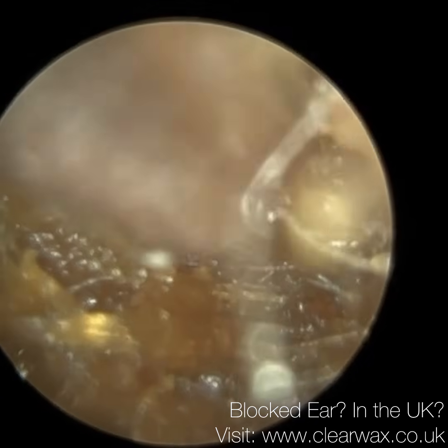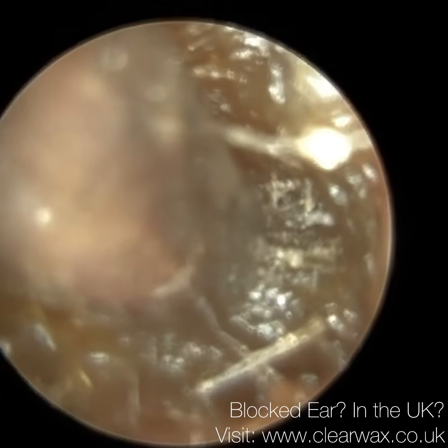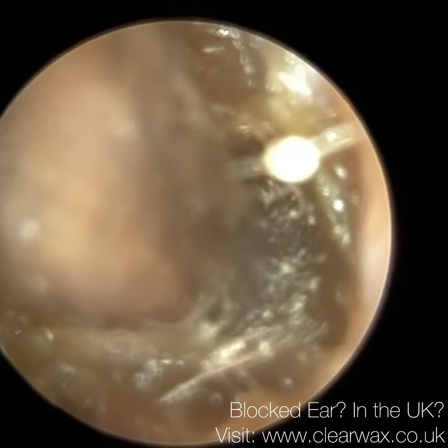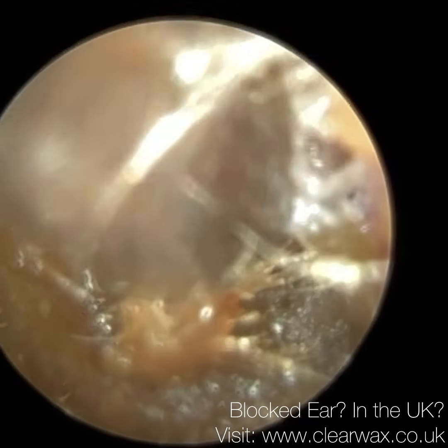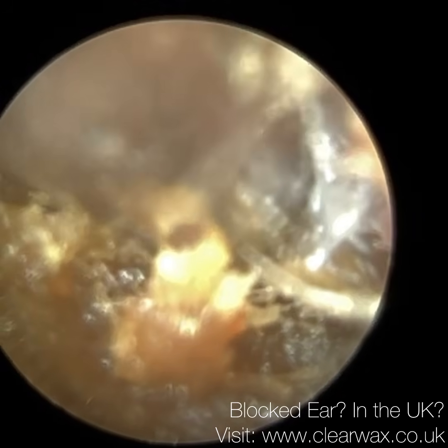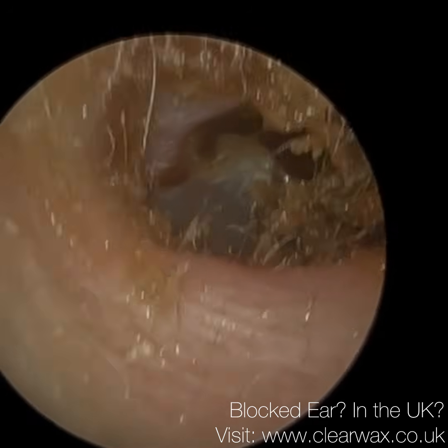The compression against the walls of the ear canal initiates a process called bony resorption and bony remodeling. And in cases of keratosis obturans, the widening is global, and when we say global, we mean it's all the way around the perimeter of the ear canal. With benign osteonecrosis, it's almost exclusively at the floor of the ear canal.